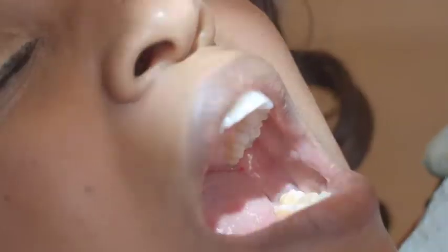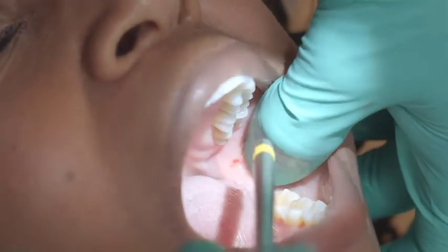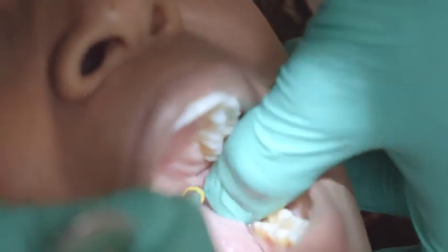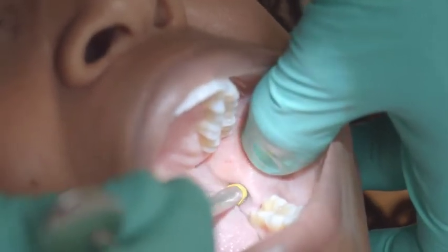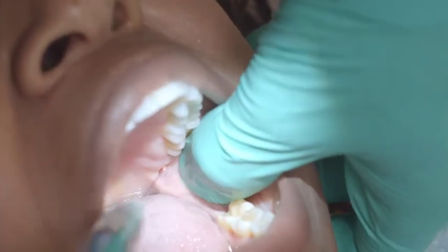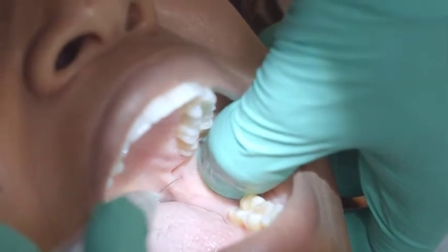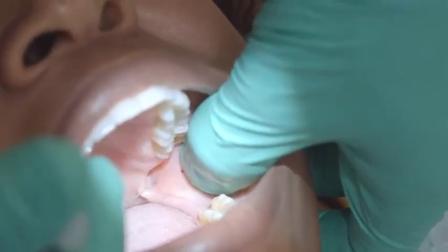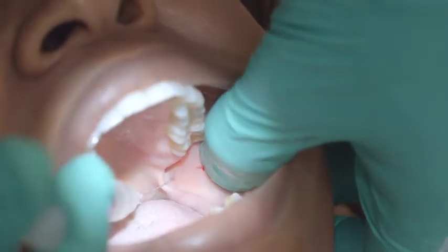What I want to do is show you where to identify the anatomy. If you look back here — open for me — the pterygomandibular raphe is right here. She's got a really nice one. So we want to go in right at that spot, just find that pterygomandibular raphe. You just want to go in gently until you get the bone — you've got your landmark.